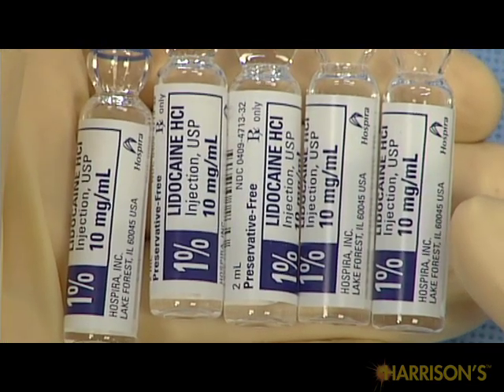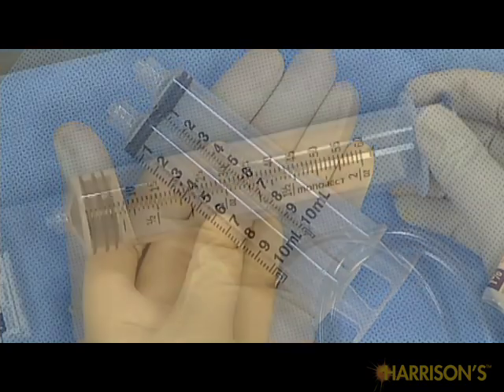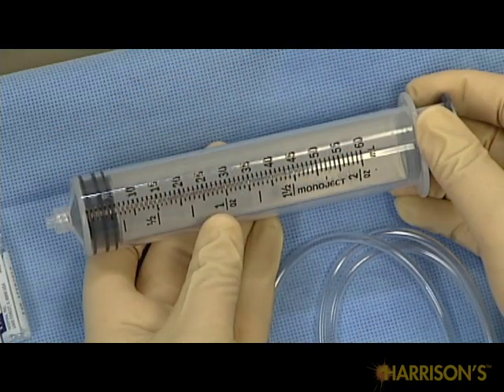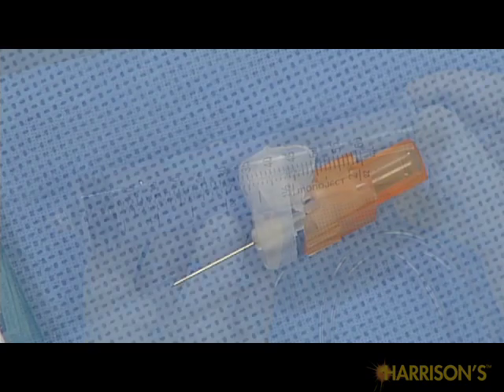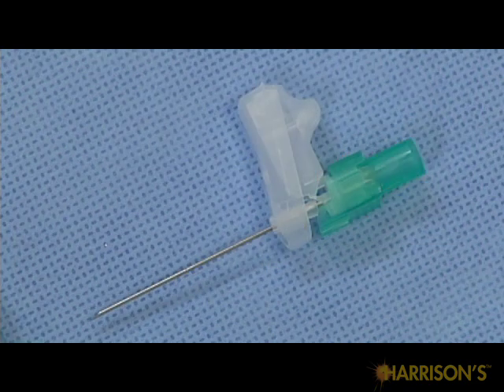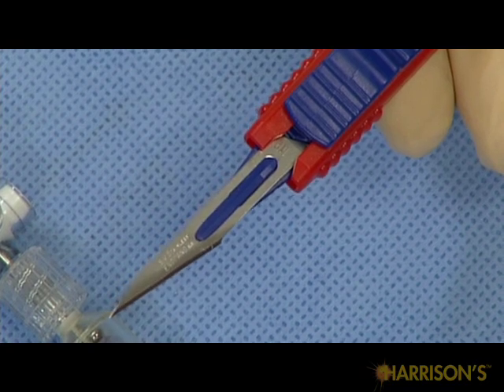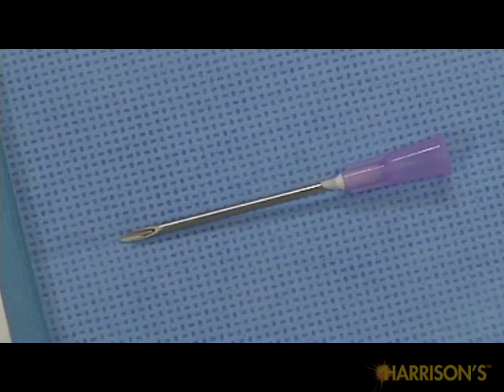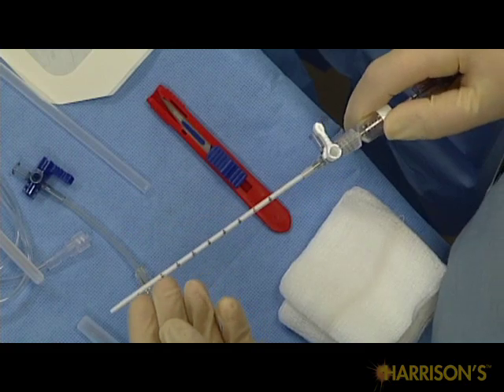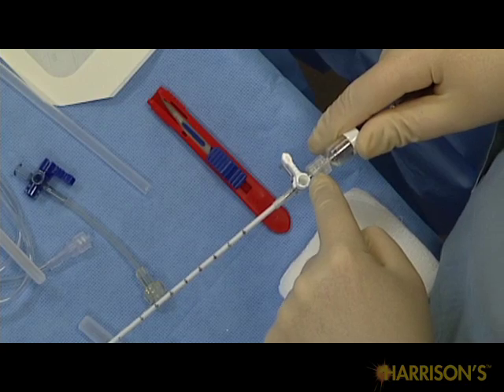1% plain lidocaine. 10 cc syringe times 2. 30 cc or 60 cc syringe. 27 gauge or 25 gauge needle, short. 22 gauge needle, long, for example, 2-inch. 11 blade scalpel with knife handle. 14 gauge needle. 18 gauge catheter over needle that can be connected to a 3-way stopcock.